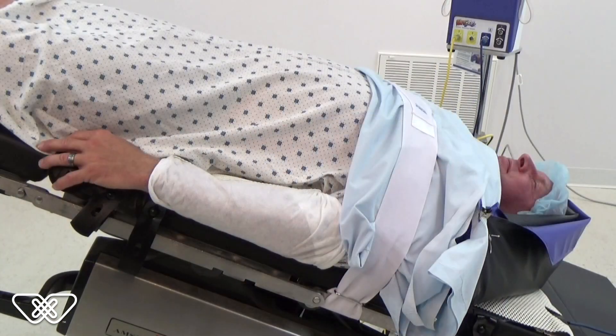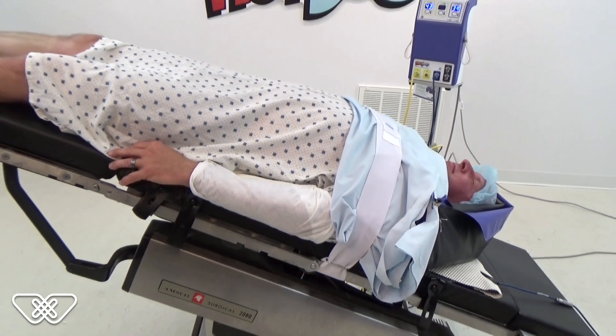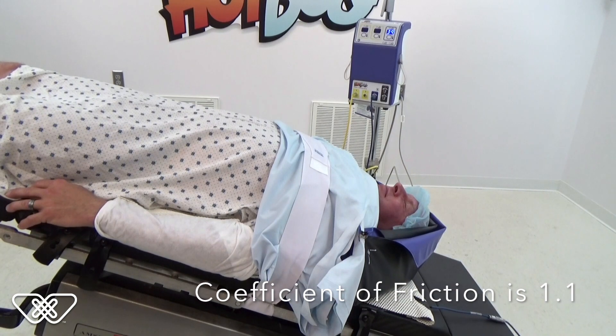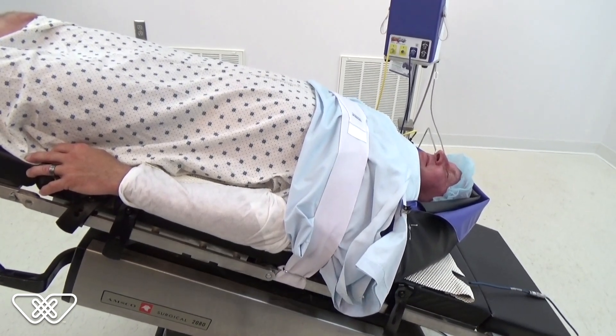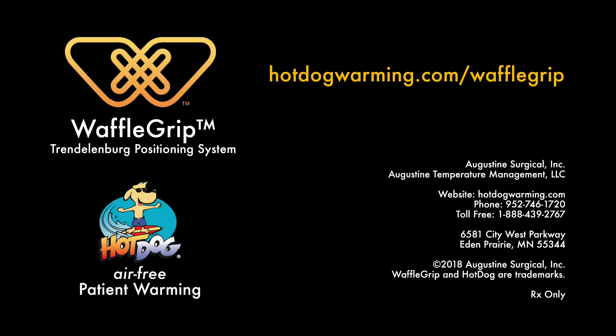The patient can now be positioned in Trendelenburg without risk of the patient sliding. The coefficient of friction between human skin and the Waffle Grip pad is 1.1. The maximum recommended angle is 40 to 45 degrees.